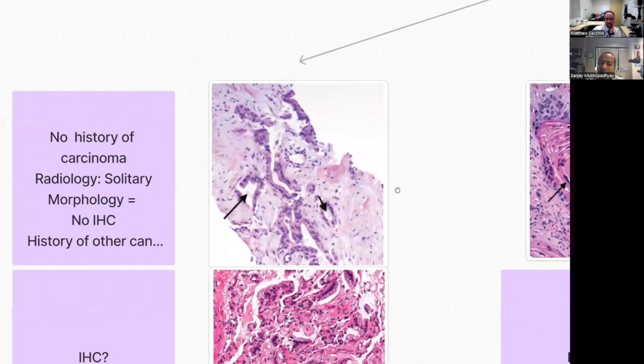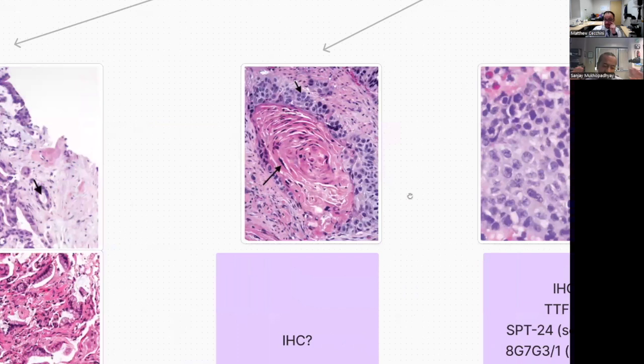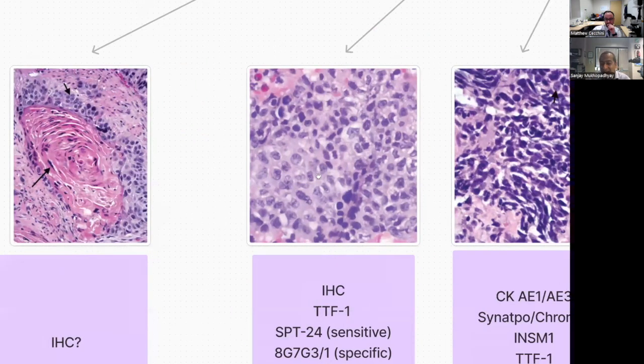So in a case like this, there is zero need to do it. I think you should never do it. In a clear-cut keratinizing squamous, zero need to do it, and you should never do it. It will get you into trouble because it will stain focally positive once in a while and is of no use.